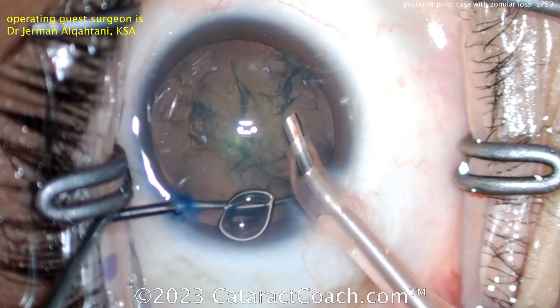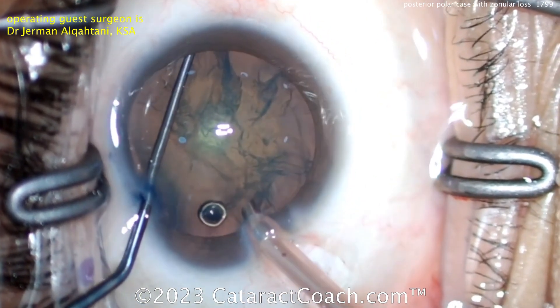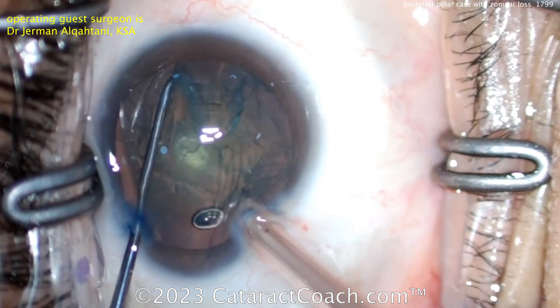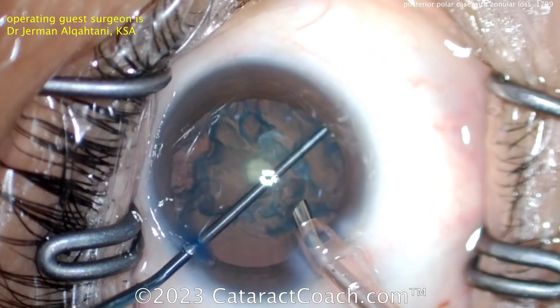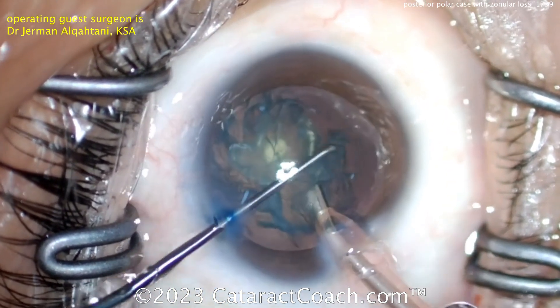We've seen other surgeons do this as well — not my preferred technique, but it can certainly be done. Now the chopper is being placed — maybe trying to chop; not a real dense cataract. I'd rather get it out of the bag at this point, and there we go — lifting it up, that's some progress.